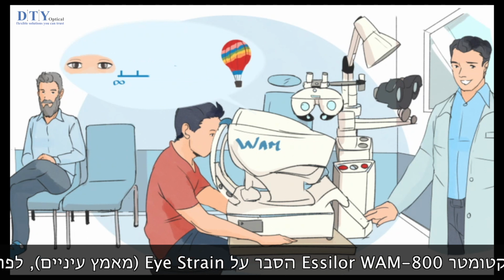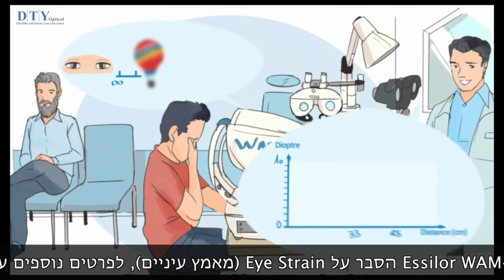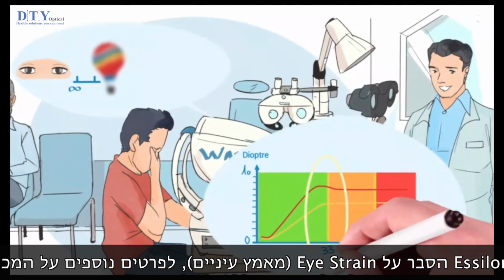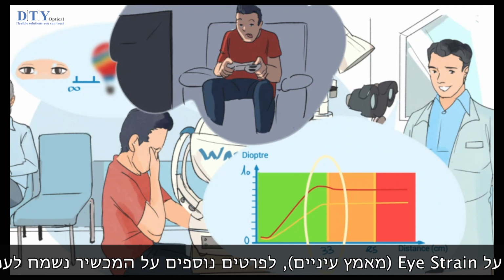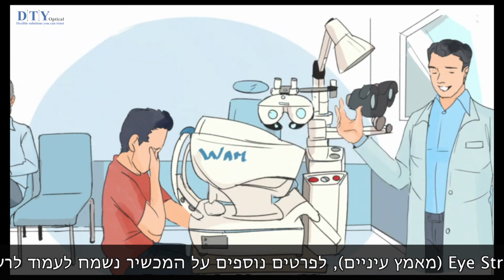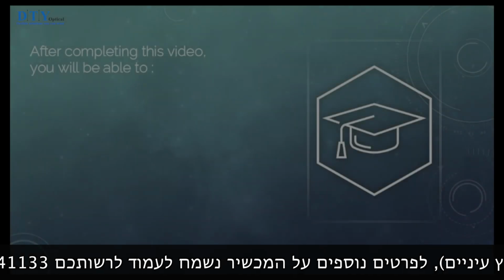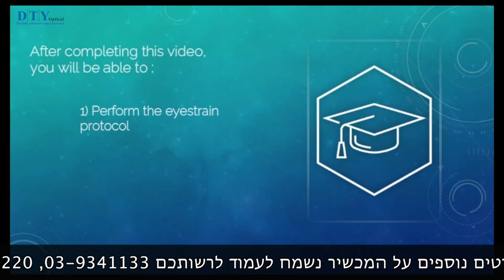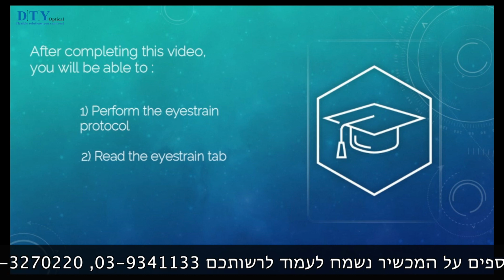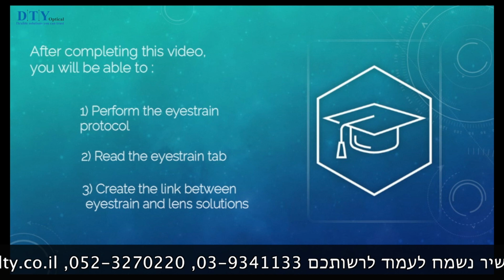WAM-800 integrates a new feature which enables a real-time evaluation of the patient eye strain when focusing on nearby objects. This feature was developed to help eye care professionals in building the lens sales pitch during the screening while enhancing their know-how. This short video will enable you to learn how to perform the eye strain protocol and how to read the eye strain tab. It will also allow you to create a link between eye strain and lens solutions such as anti-fatigue.